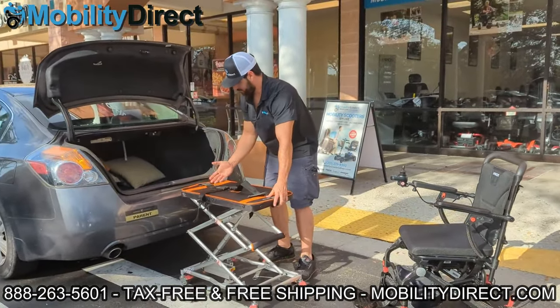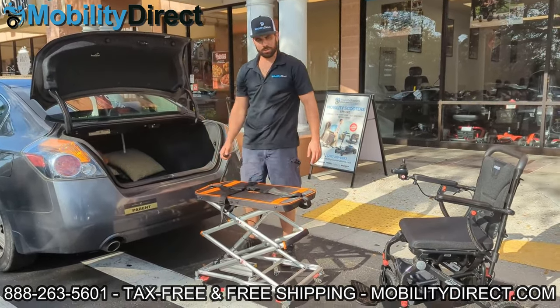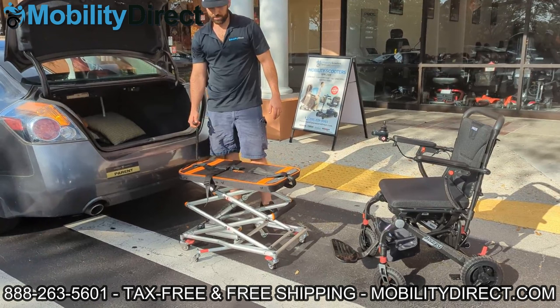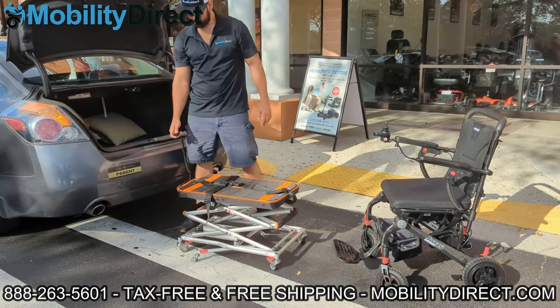We wanted to demonstrate that it can lift — and it does lift higher. It can lift all the way up to 35.8 inches, which is plenty for most SUVs and trucks. Once you have it all the way lifted, you can easily roll the power wheelchair or scooter into the trunk of your car instead of dead lifting it, because wheelchairs and scooters are not light — they're pretty heavy.